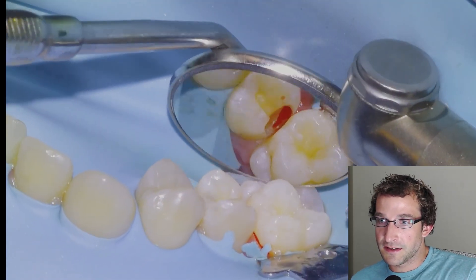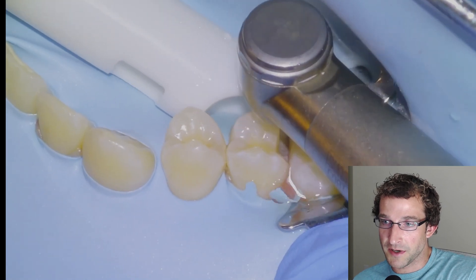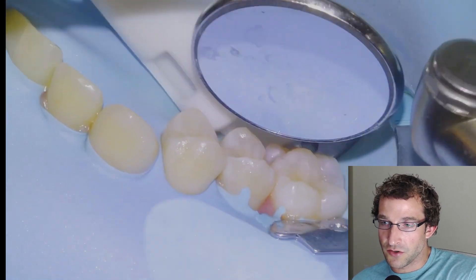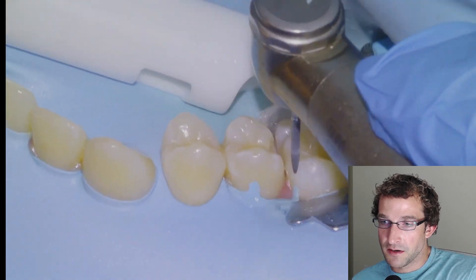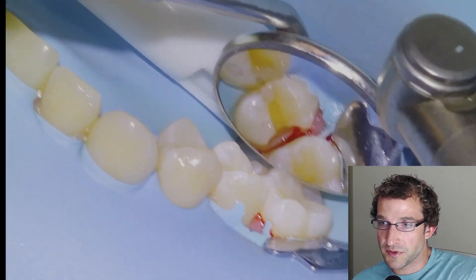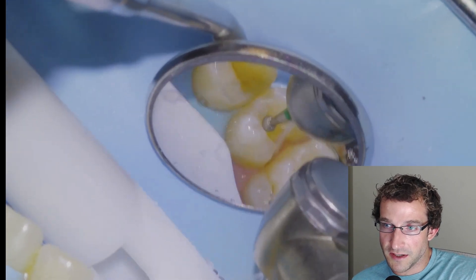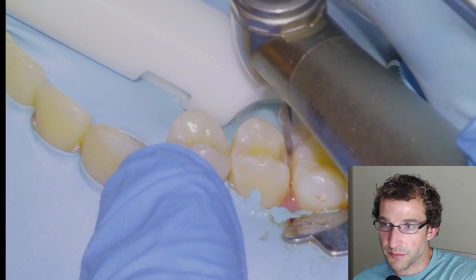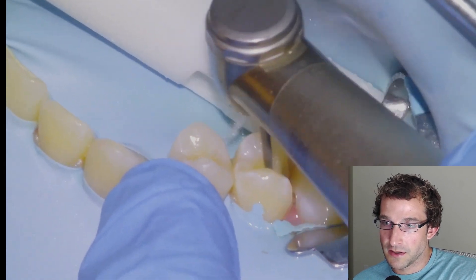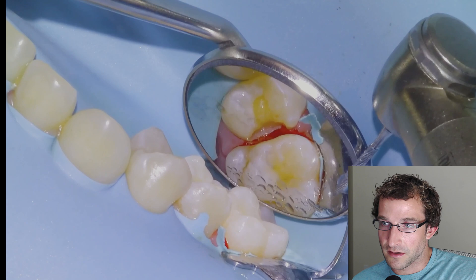We'll carry on like that — still a ways to go. Once I get close, sometimes I'll take a carbide flame to open up the rest of the contact. We'll grab the carbide flame and just open up the contact, then refine the dovetail with the round diamond and smooth off any sharp edges in the prep before going to restore. That's pretty much good to go.